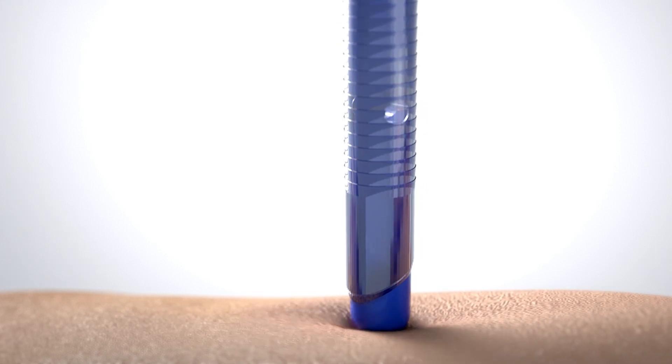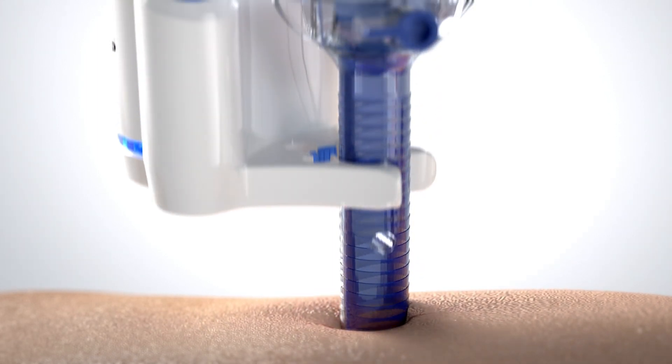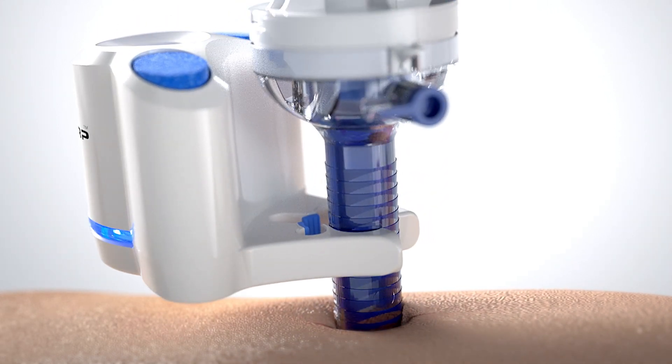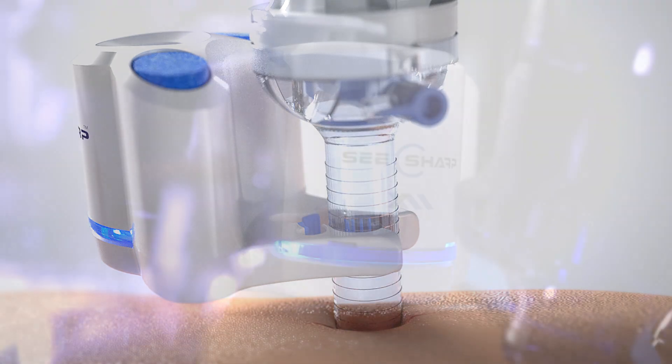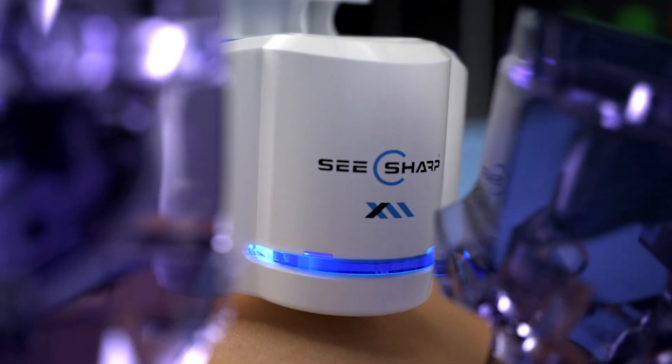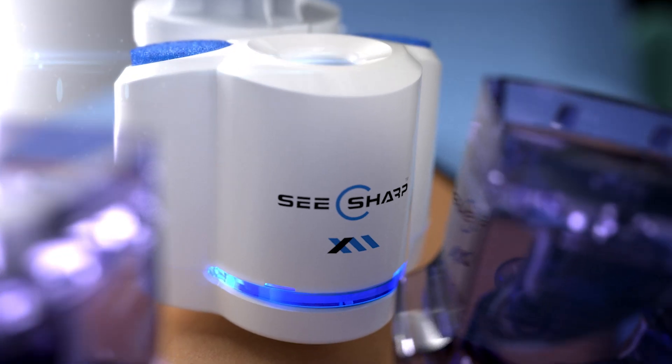Next, insert the combined trocar and C-Sharp into the patient. The same attachment technique is used for trocars already placed in a patient. The C-Sharp is now conveniently located within the surgical field and ready for the duration of the procedure.